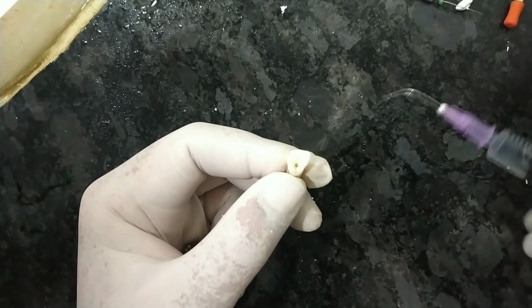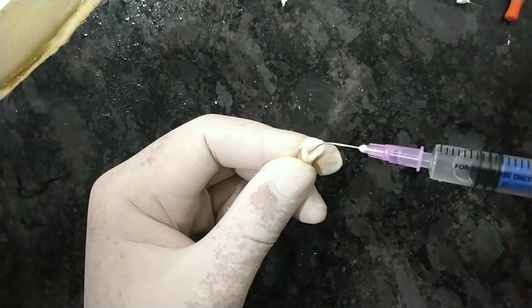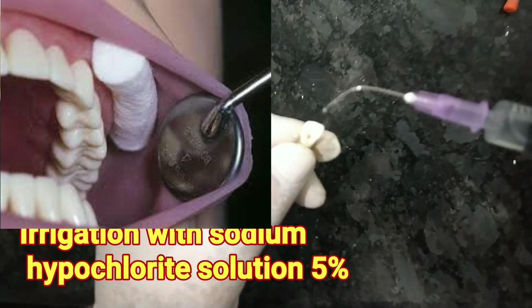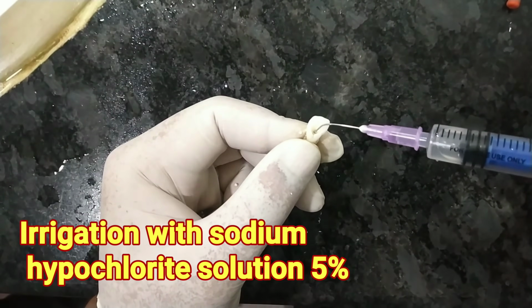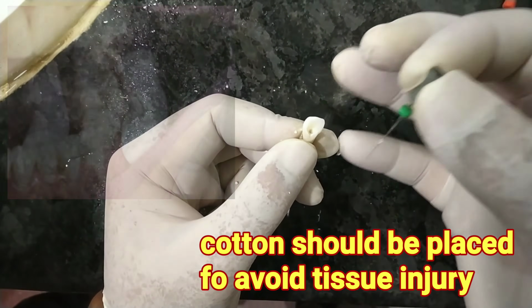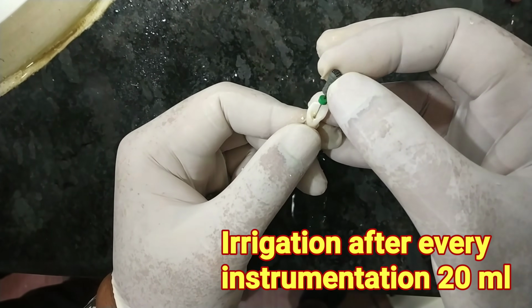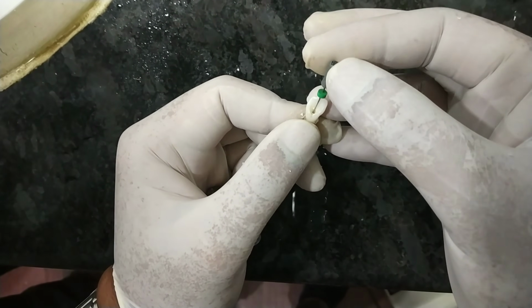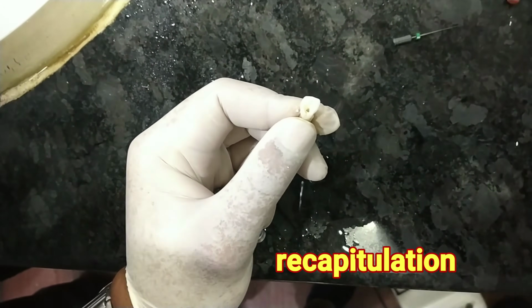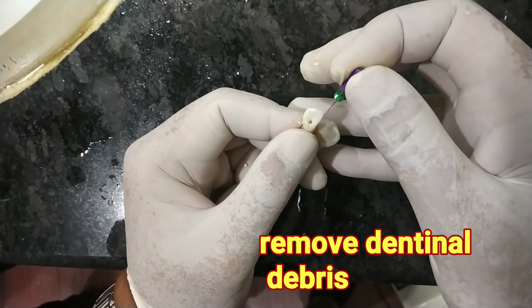After using the SX file, you have to again irrigate with saline and sodium hypochlorite solution in equal concentrations. I am just doing the irrigation a little bit faster because I have to make the video short. After that, we have to again recapitulate with the number 8 file. There are various ways of doing it. Suppose you are doing with the number 8 file, then you again go with the number 10 file, then number 15 file. This is purple in color, this is K file number 10.